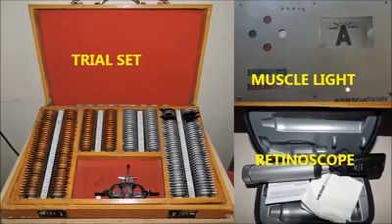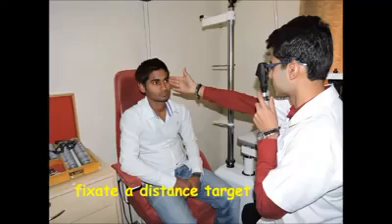For performing retinoscopy, we require a trial case, a target and a retinoscope. We ask the patient to fixate at a distance target so that the accommodation of the patient's eye relaxes. The procedure is performed at an arm distance, known as the working distance, and the conversion of this working distance into diopters will give us the power of the working lens.